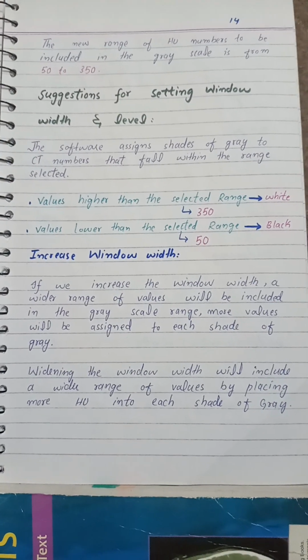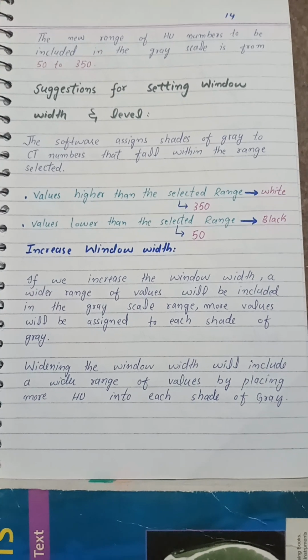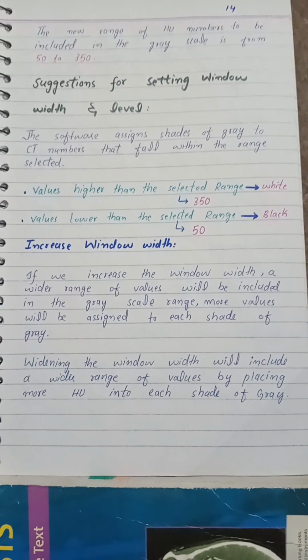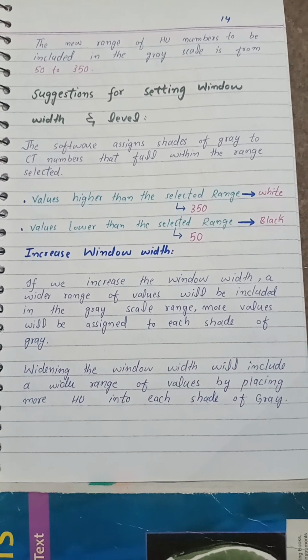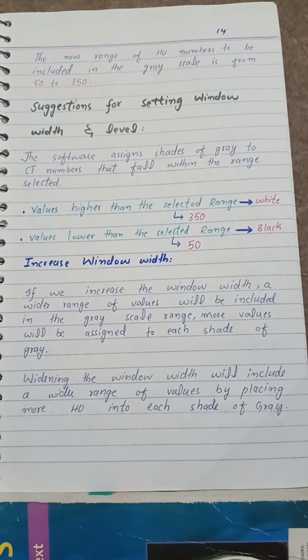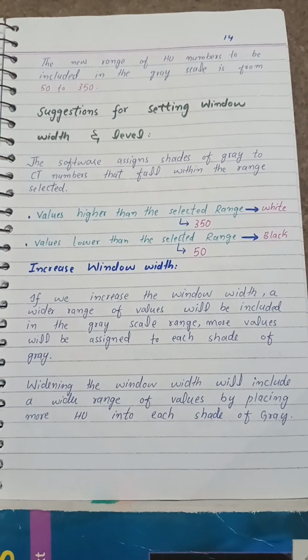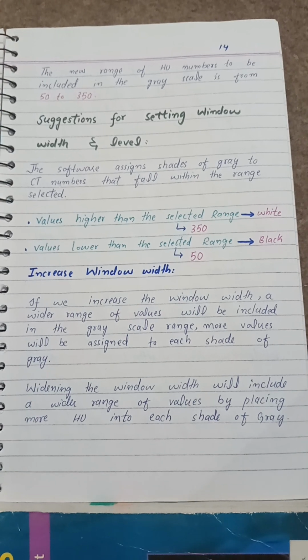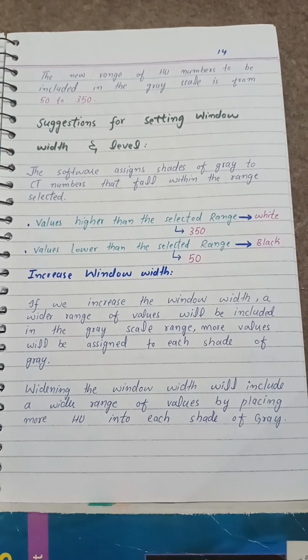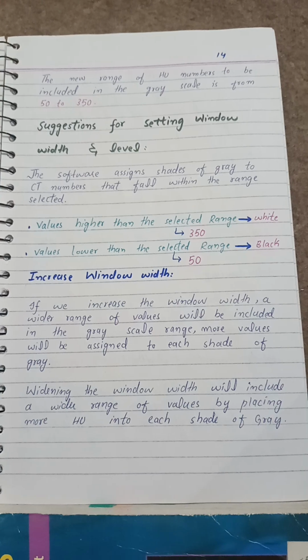Suggestions for setting window width and level. The software assigns shades of gray to CT numbers that fall within the selected range. Values higher than the selected range, 350, are white. Values lower than the selected range, 50, are black.